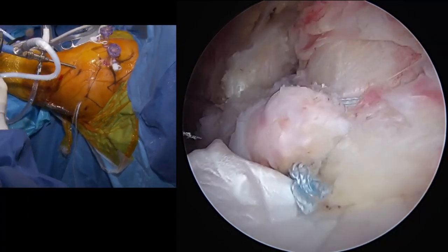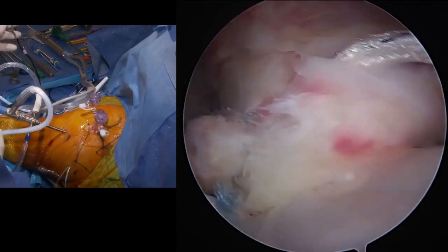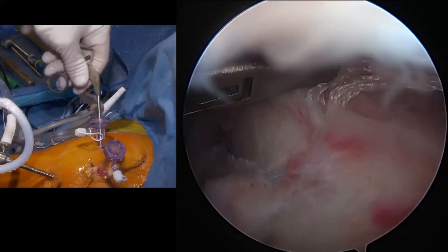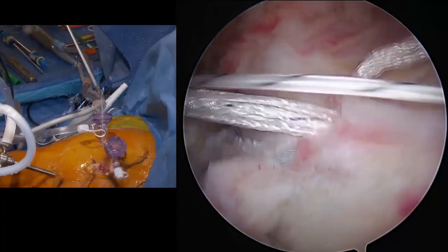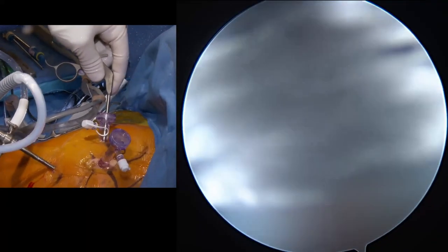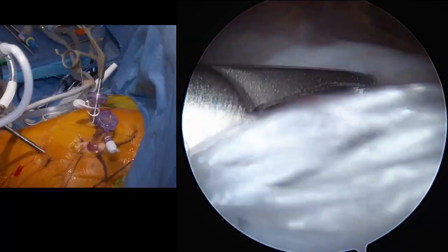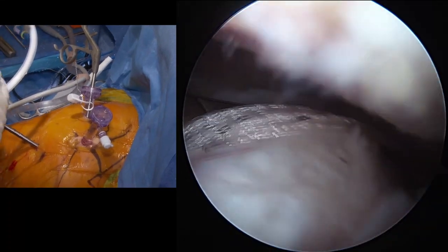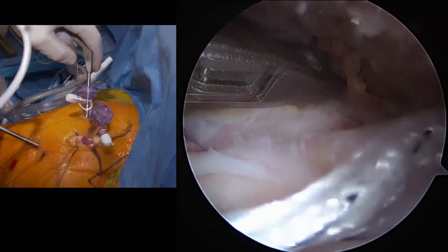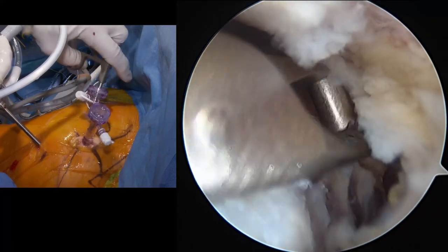Okay, and let's have a fiber tape retriever. So we have a blue and a white, the white up front. So we'll take one of our whites and just pull that out the front. And we're about ready to put our lateral anchors in place. We'll move that one out of the way. Then we'll go lateral or medial to this and grab the other blue. So it's just out of our way and not captured in our repair, if I can find it. And he's here somewhere. Further back than I expected, so just kind of trapped over the top. There we go.